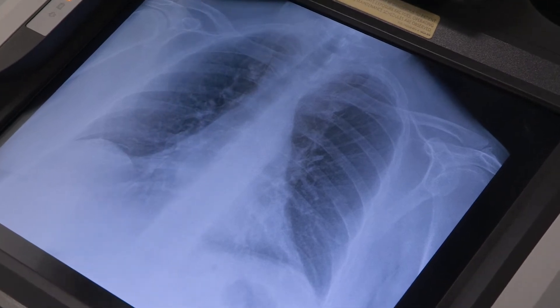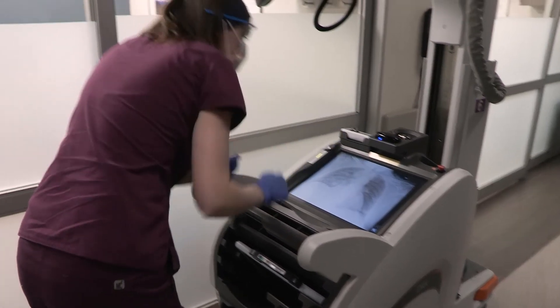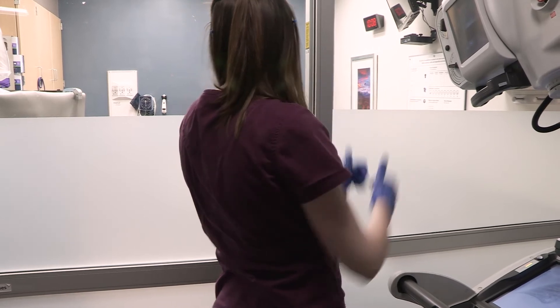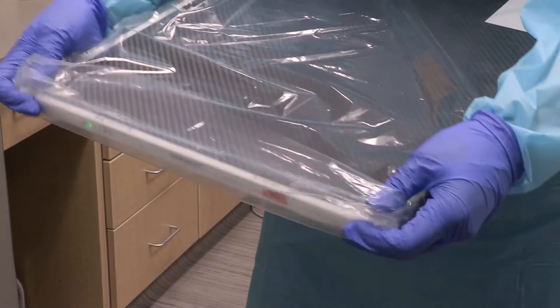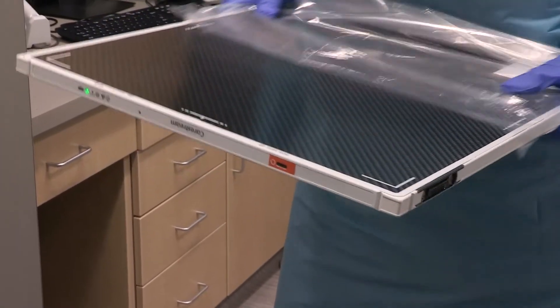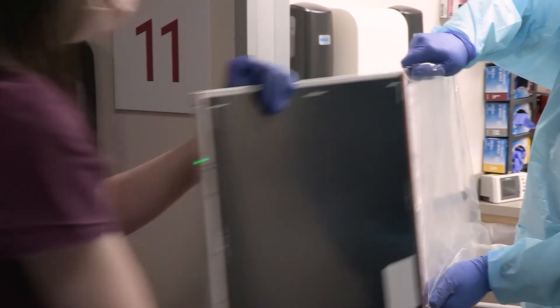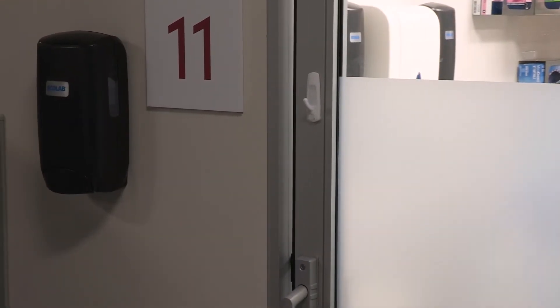If the x-ray needs to be repeated, the technologist will communicate any adjustments to the nurse through the glass. If the image is acceptable, the nurse and technologist can begin to clean up. The nurse will remove the detector from behind the patient's back, fold back the covering, careful not to touch the detector directly. The nurse will pass the detector to the technologist through the doorway with sterile technique, keeping the covering inside the patient's room.